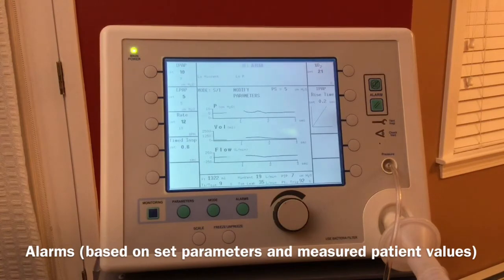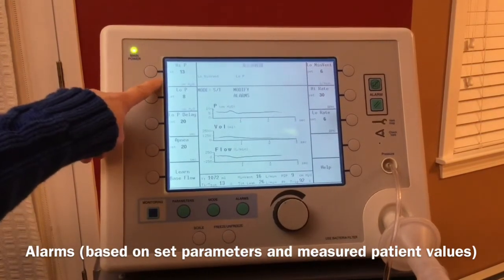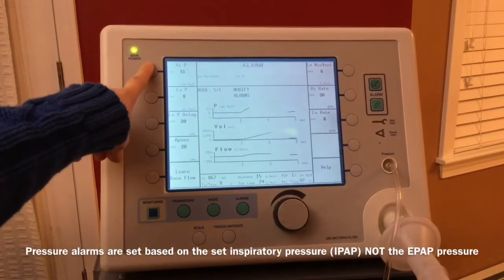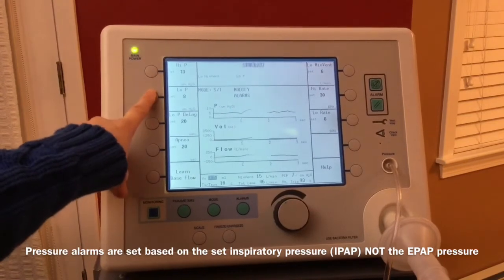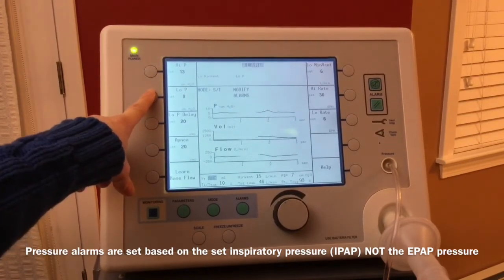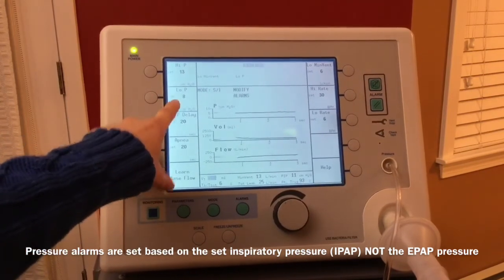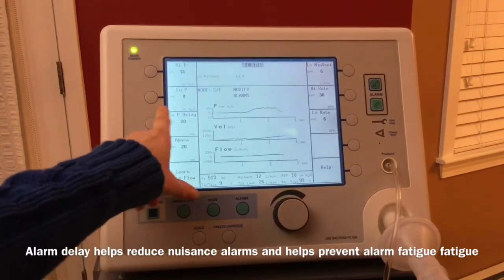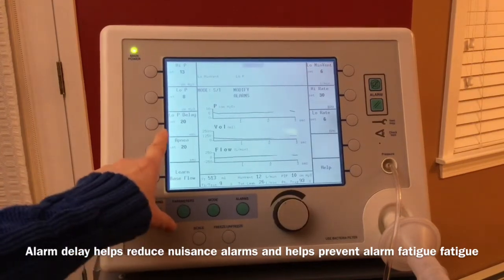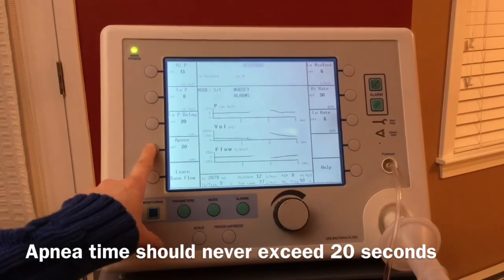Now that we've got our settings in, we have to go into our alarm limits, just like we did in the CPAP mode. So we'll go into the alarms, and again, our high pressure is going to be above our set inspiratory pressure. We were set for an inspiratory pressure of 10, so 2 or 3 above that is 13, that's perfectly fine. The low pressure, again, is on the inspiratory pressure. So our max inspiratory pressure is 10, so 8 for a low pressure is fine, that's 2 or 3 below, so we're good there. The delay for the alarm to sound, if we do go below 8 centimeters of pressure, is 20 seconds. That's reasonable. And the apnea time, if the patient were to stop breathing, is 20 seconds. So it would alarm for that.